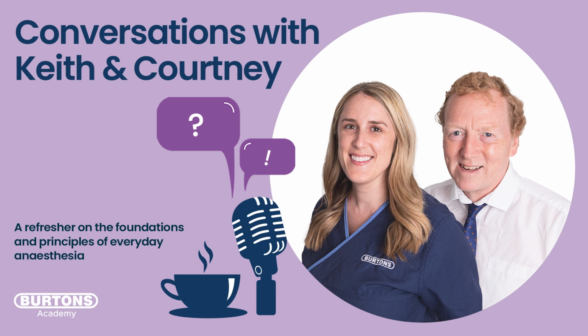But what's the practical implication of that? What are they going to do if it does say 93%, and they reposition and whatever, and it still says 93 and it's continuing to fall? So there must be something there that's affecting oxygen saturation. Yeah. And there are only two causes. The only two causes are hypoventilation and shunt. And it may well be that the case itself would suggest there's a high percentage of shunt. But if not, it's hypoventilation.